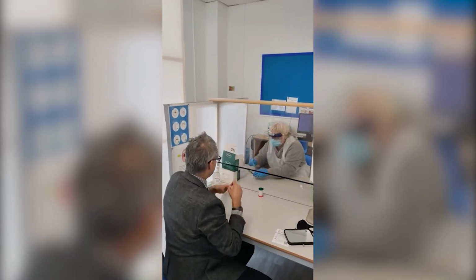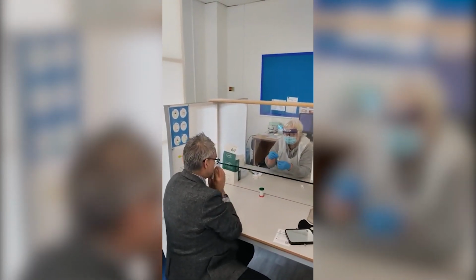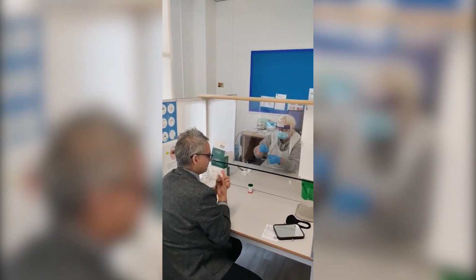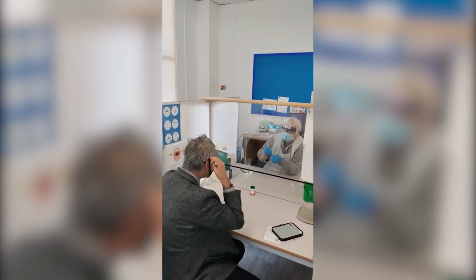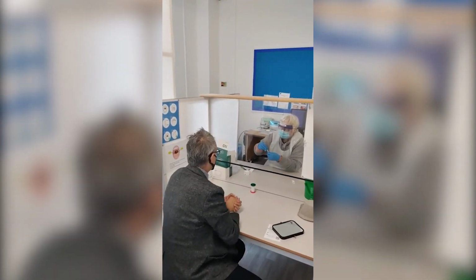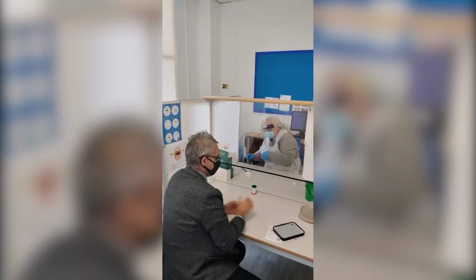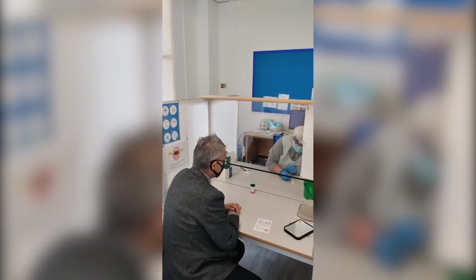So I'll put it down into the extraction fluid. And we turn it around a little bit like that. Okay, so you want to use some more around here, you can do tissues, and if you want to put your mask back on. Lovely. That's for you. So turn it round like that. Squeeze it. Put the end on there. And you throw the swab away. And then I'll put 2 drops into the test there.